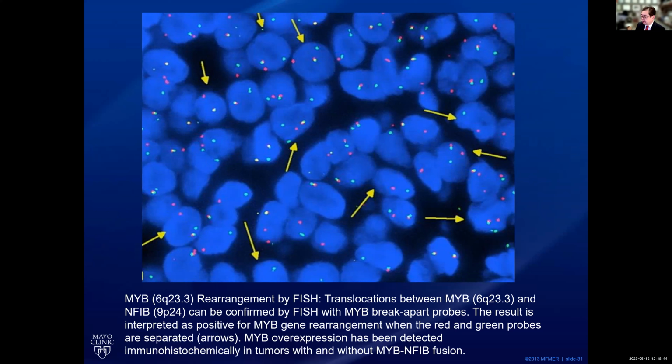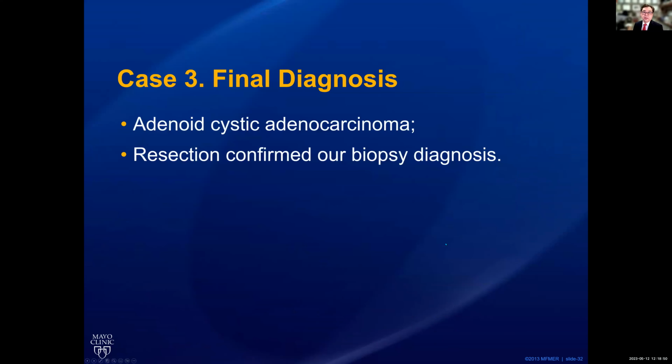So the grading of adenoid cystic carcinoma is based upon how much solid area the tumor has. If it's 30% or more, it's grade 3. If it's pure tubular, it's grade 1. If you have a combination of tubular, cribriform, and a little bit of solid, it's grade 2. The reason I comment on that is that salivary gland tumor grading is getting more and more important because our colleagues request that. In older days, even 5 years ago, we didn't care too much because they didn't need that information to treat this patient differently.